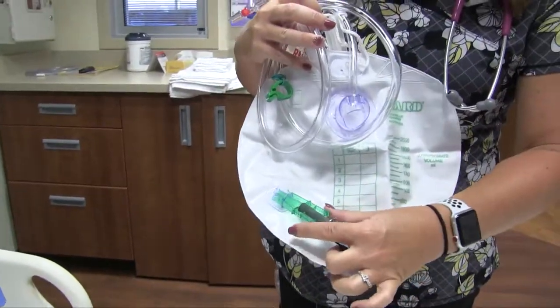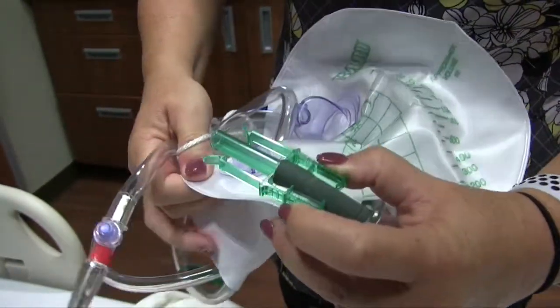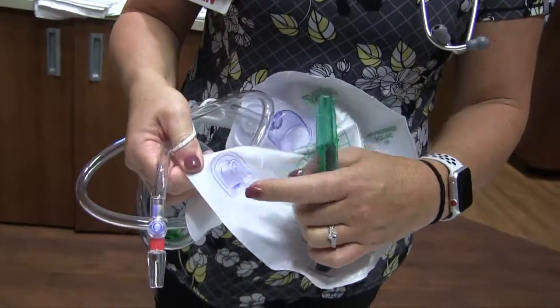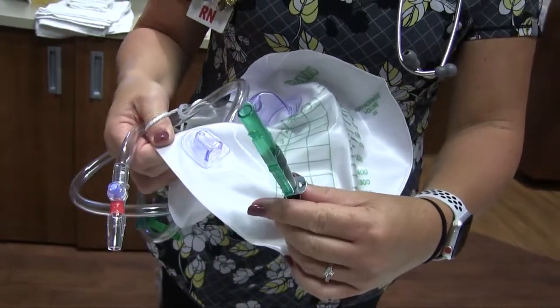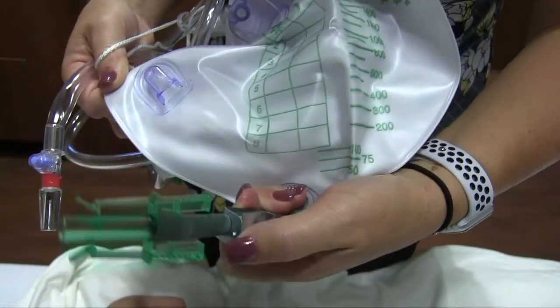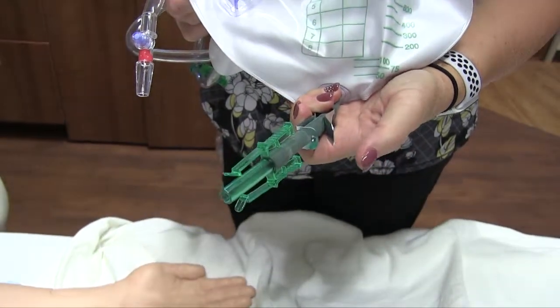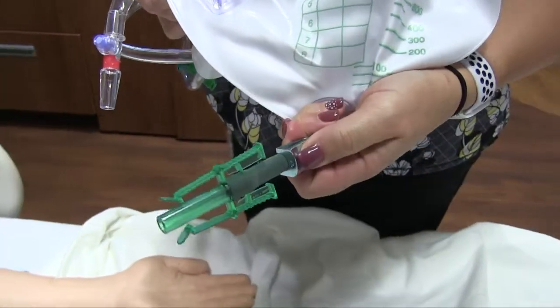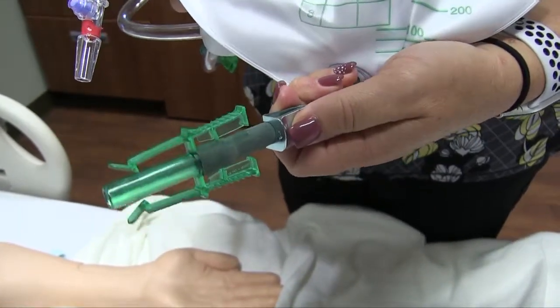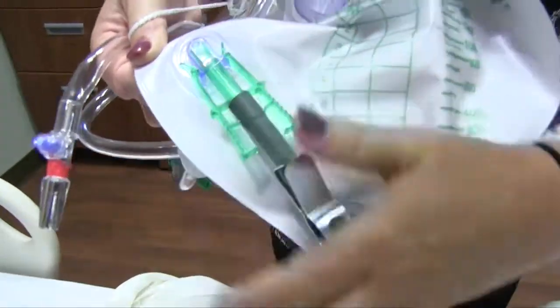If you see here, you've got this little pinching system. You're going to want to pinch this tightly and it'll pull out of its little docking house. And that's all this is, a docking house. To actually open and empty the bag, we are going to flip this right here and it opens. You'll be able to expel the urine, and when you're done, you need to push it shut just like that. You'll hear that click and you'll feel it too. And then when you're done, the tube needs to go right back into its home.